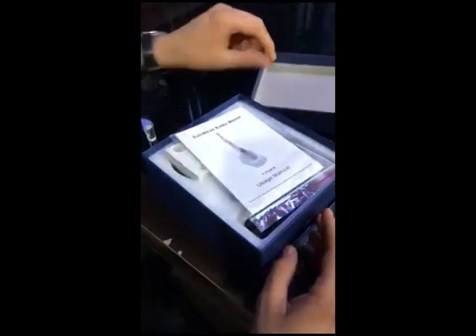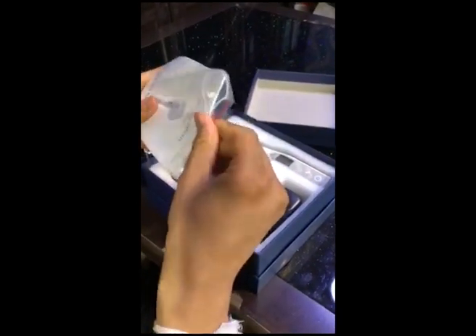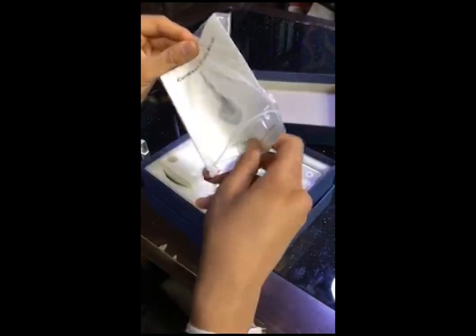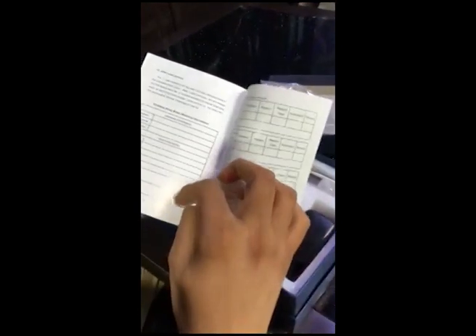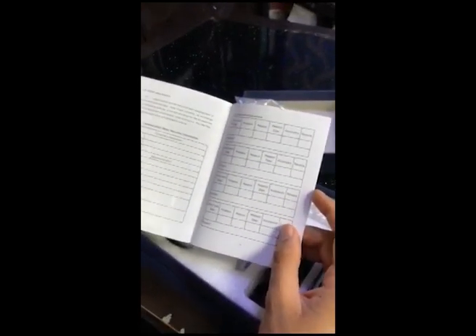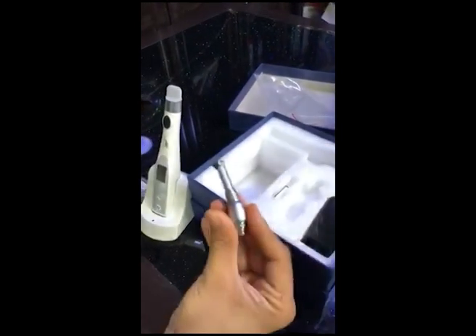What we have here: we have a user manual — it has all the descriptions and everything inside. We also have a warranty card. Make sure when you buy this machine you have the warranty filled up from your dealer — it's very important to claim your warranty. This is the stand, this is the endomotor, and this is the handpiece.